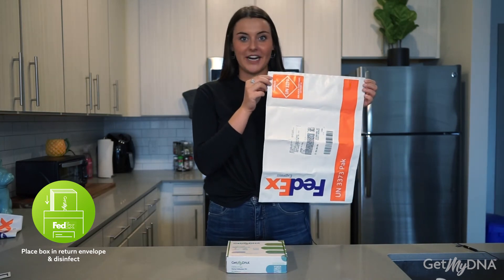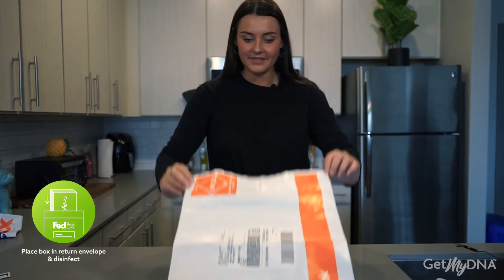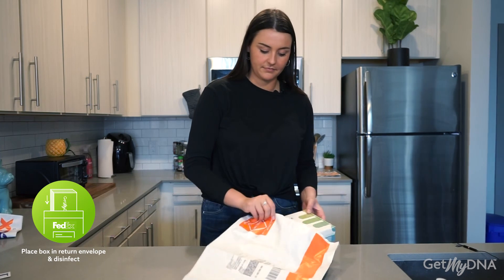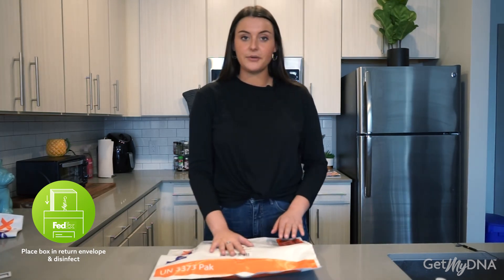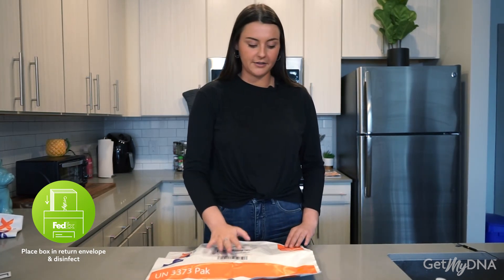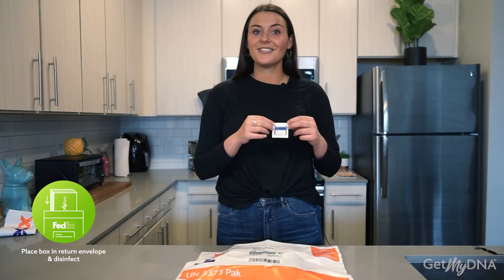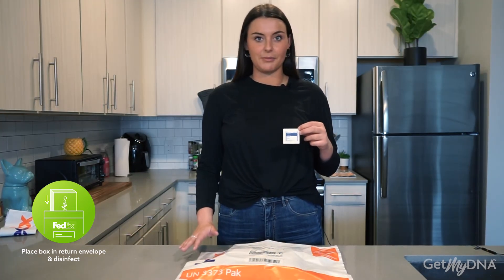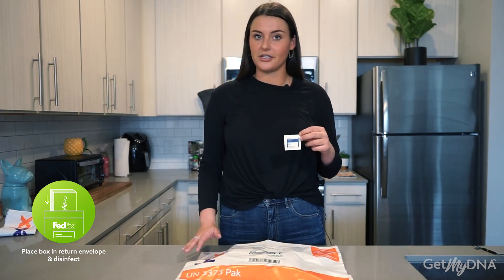Locate your FedEx shipping bag provided to you in your kit. Then take the box containing your sample and place it into the FedEx shipping bag and securely close it. Locate your alcohol prep pads and sanitize the outside area of the FedEx shipping bag prior to dropping off at the FedEx location.